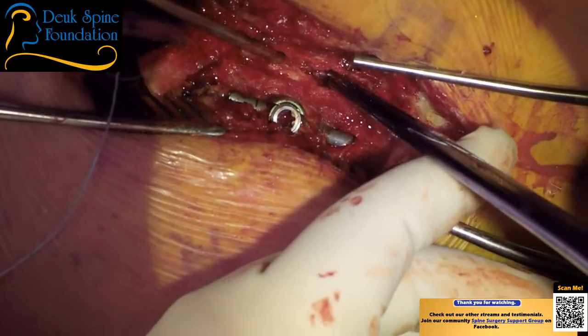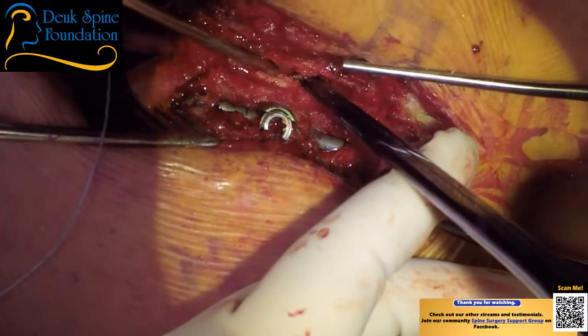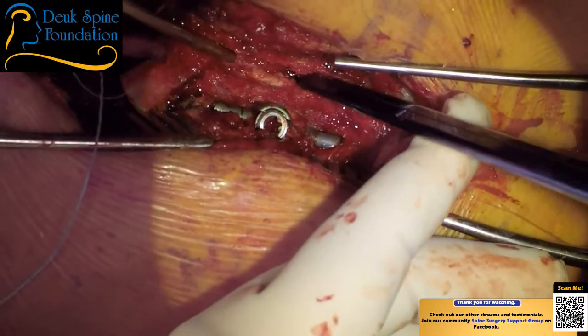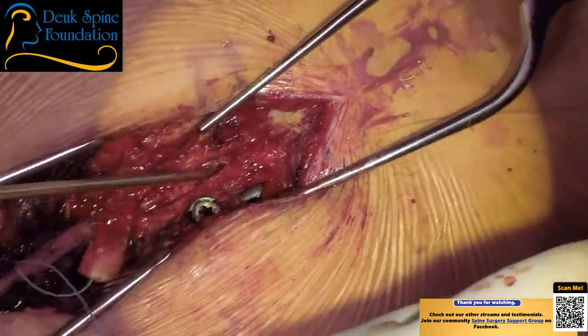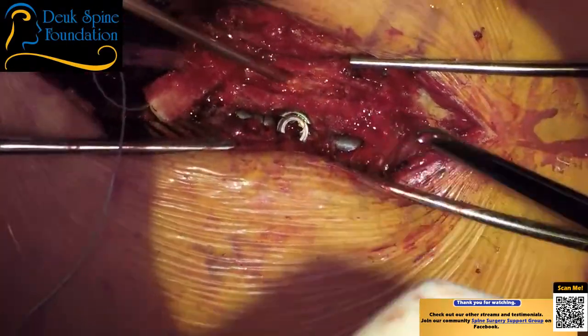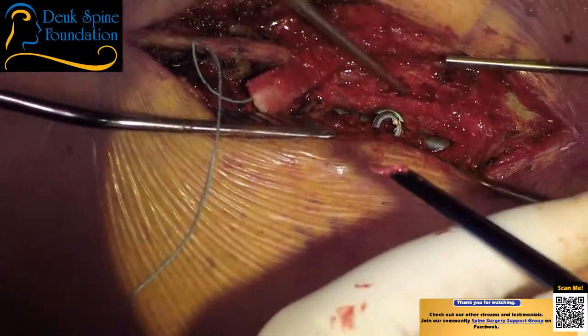So I'm going to come on this side and get under it. There you go. And bite it out, one little bit at a time. It's a 3 millimeter footplate, so we're getting about 3 millimeters a time.